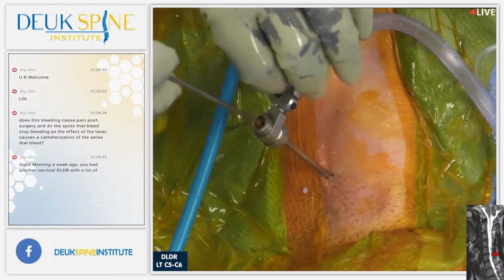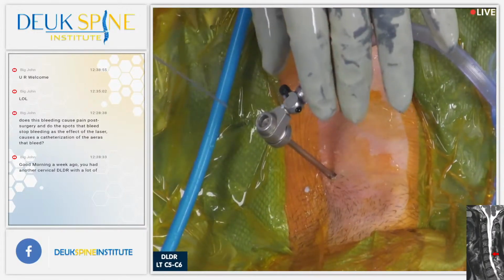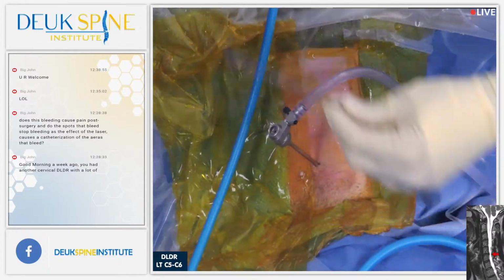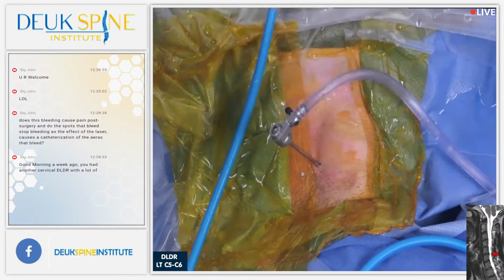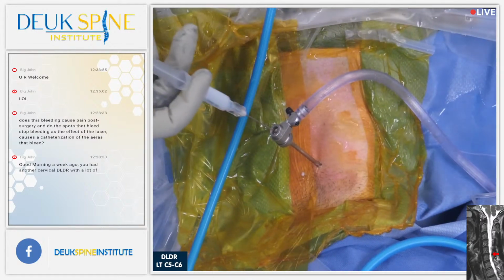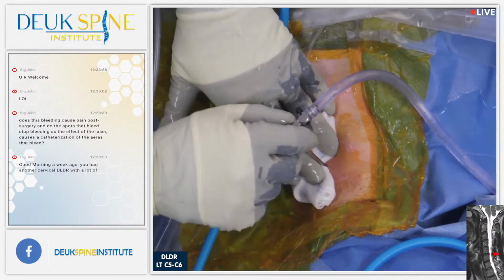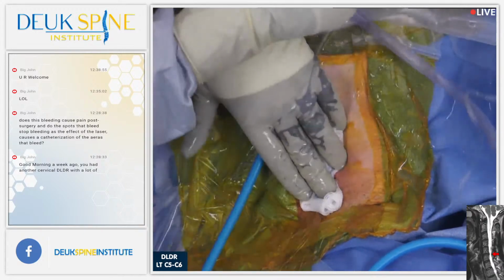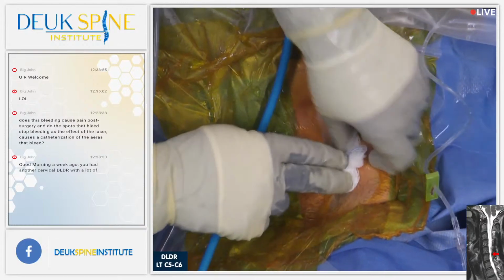But, you know, herniation is not one piece. It's usually a lot of pieces. And the disc gets smashed. So whatever caused this, it's trauma, some kind of trauma. And the patient smashes the disc, the nucleus, into pieces, which you see there, and they also tear the wall. And when you tear the wall, then the pieces can escape, and that's where you get a herniation. We're the first in the world to describe that. No one else has ever known that or talked about it. All these other surgeons think a herniation is one piece, and they talk about getting the herniation out. But the herniation is really, I would say on average, at least 25 pieces.